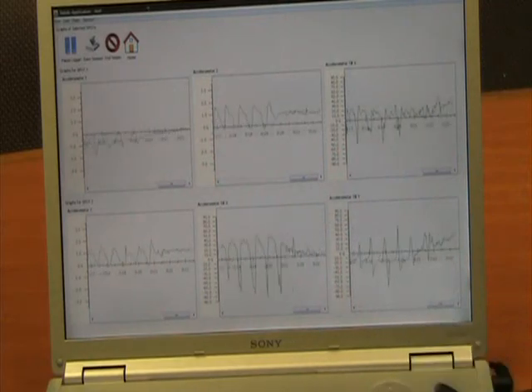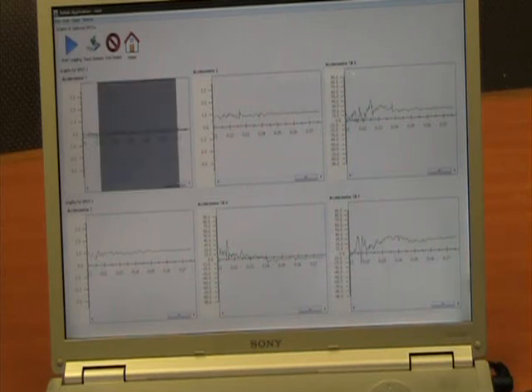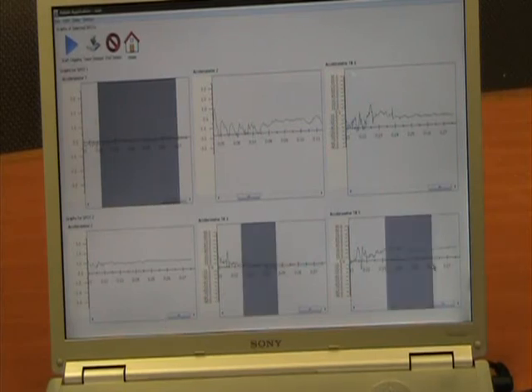and once we are done, we can pause logging the data, and we can bookmark, or we can label certain areas of measurement. If you want to magnify it, we just double click and it becomes bigger. If you want to go back to the previous screen, just click there, and we can tag data from any of the sensors and save it. We can save any session.